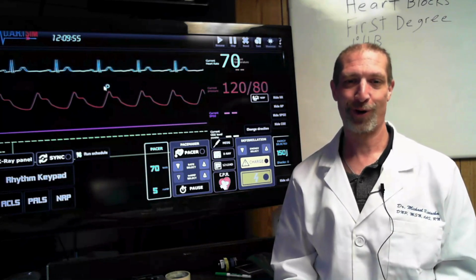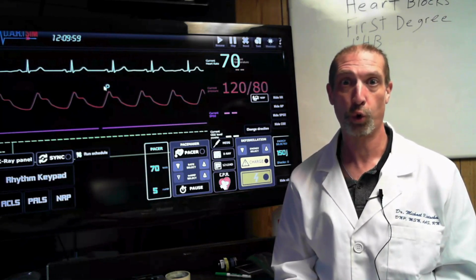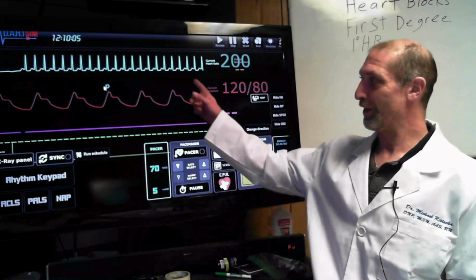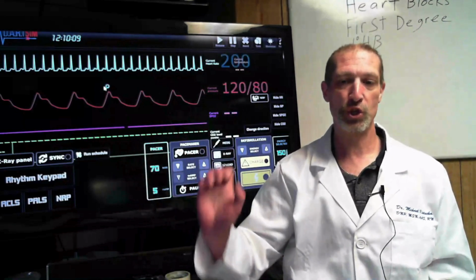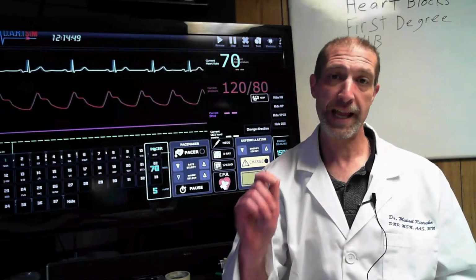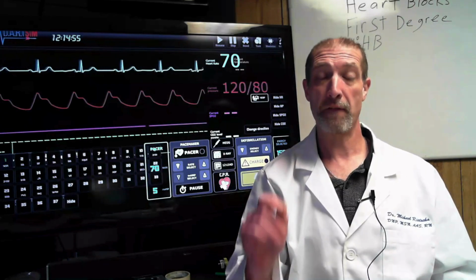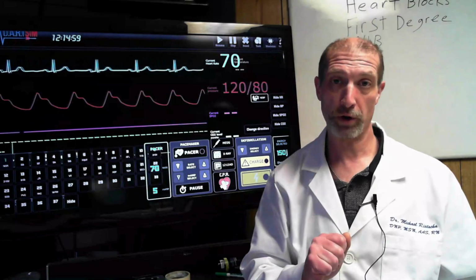When you hear the word heart blocks, what is your first reaction? Is it, oh crap? Do you feel like your heart is starting to race? Do you feel if you were hooked up to a monitor, this is what would be showing? If that's the case, you are not alone. Studies have shown that 88% of nurses have a difficult time identifying first degree heart blocks on an EKG monitor.